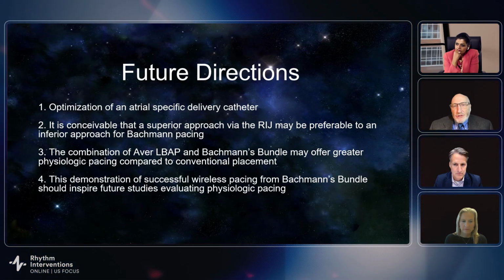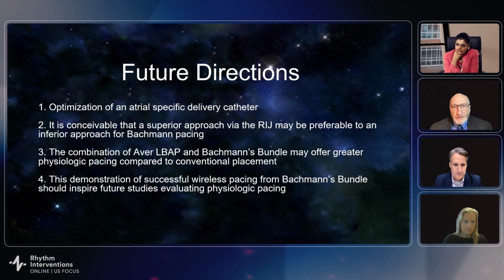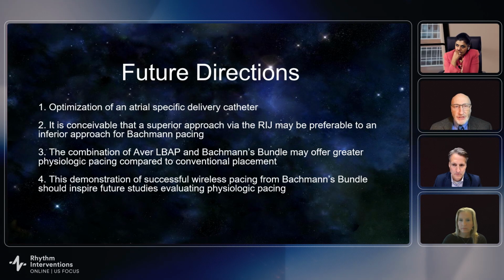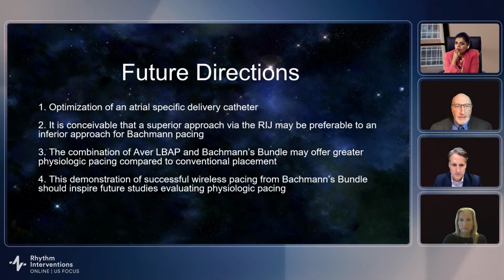But as we look towards physiologic pacing, the importance of activating the ventricles as homogeneously as possible with early left atrial activation will be very important for mitral contraction.